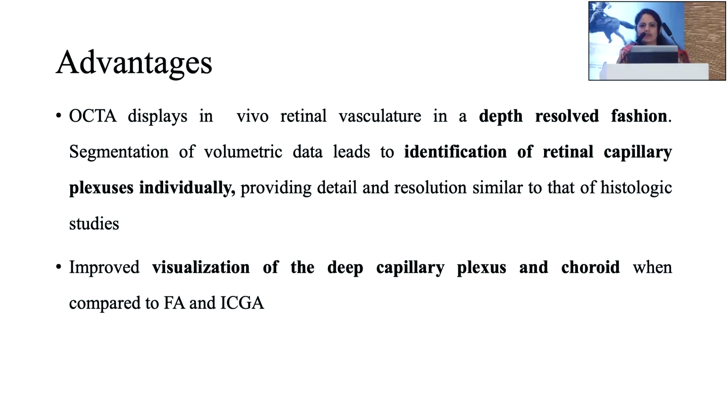So why Octa? Till now, our mainstay of retinal vascular imaging has been fundus fluorescein angiography and ICGA. Octa is non-invasive. It is not using any dye. So the risk posed to the patient because of the dye, which can range from a mild allergic reaction to anaphylaxis, we do not encounter with Octa.